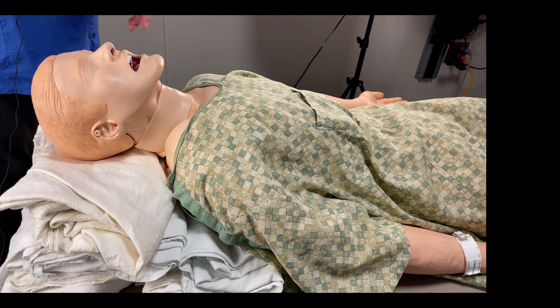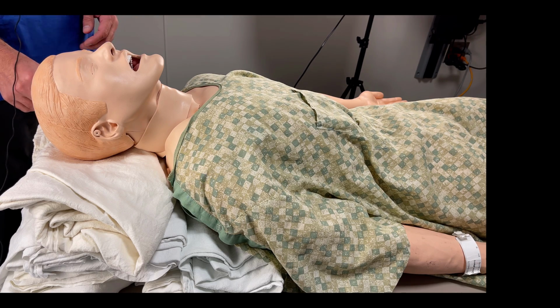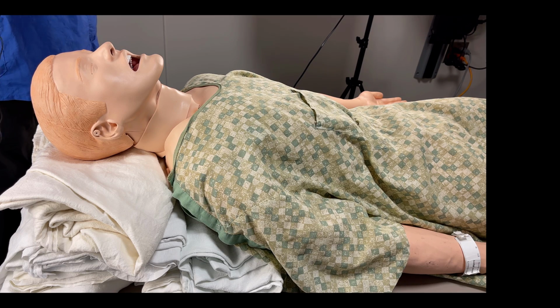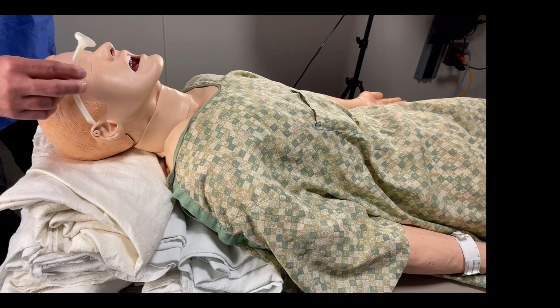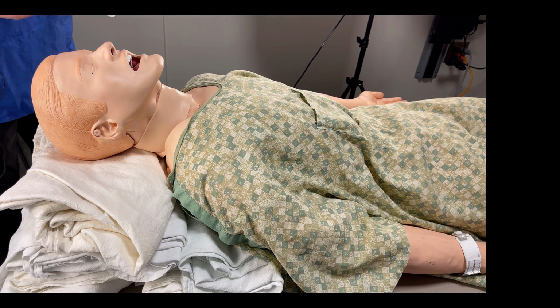Okay, folks, so I'm just going to quickly demonstrate what we'd already talked about and discussed regarding the oropharyngeal and nasopharyngeal airway adjuncts. Let's start with the nasopharyngeal airway. I have one here, and I have some lube as well, so I normally lubricate this, but I want to make sure I size it, and we talked about sizing it from the nare to the ear, so it's pretty close. And I'm going to put the bevel towards the septum, so I've lubed it.